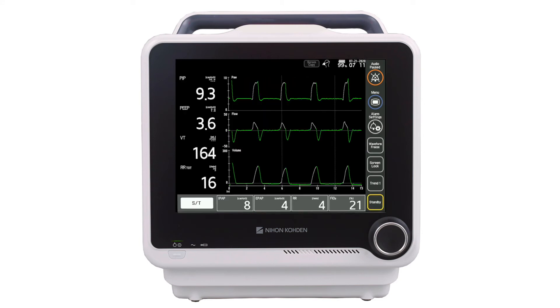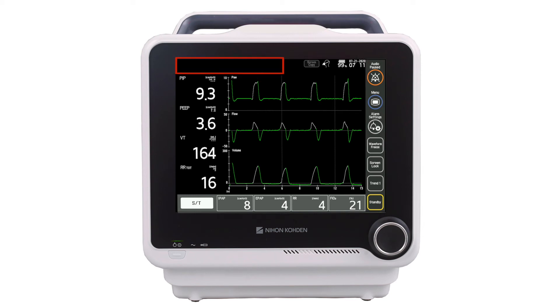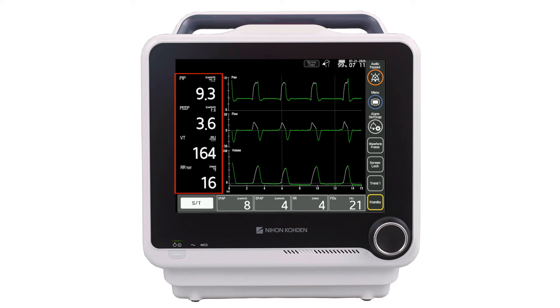The GUI is divided into five sections. The system information section contains the alarm messages area, screen copy button, patient interface indicator, main battery status, and date and time details.